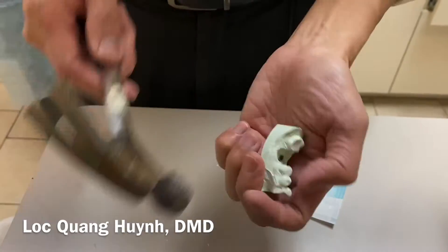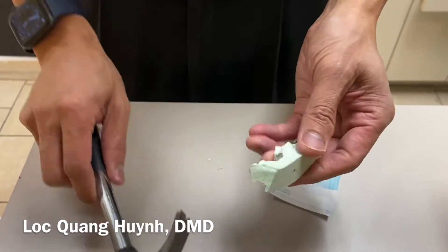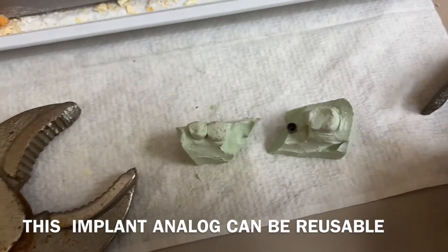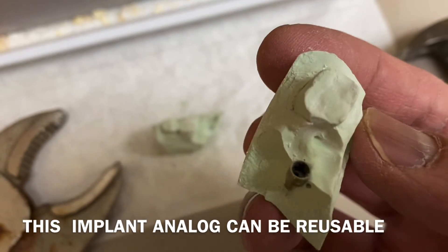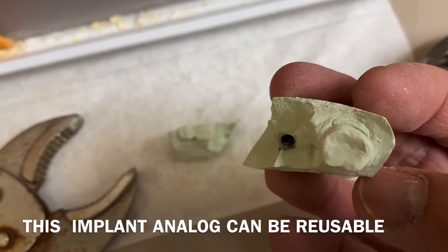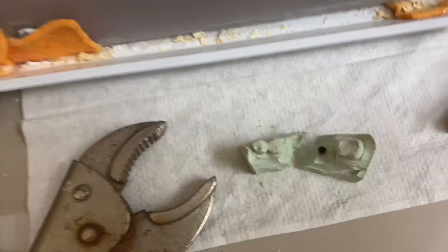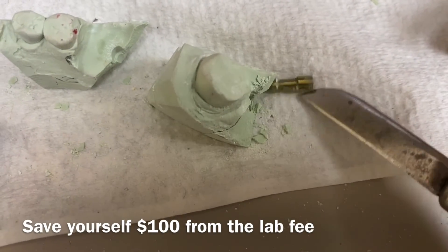You break it right there at the weakest point and it's going to break, and you can easily take out the implant analog right there. You put the buffalo knife in, twist, and it should come right out.